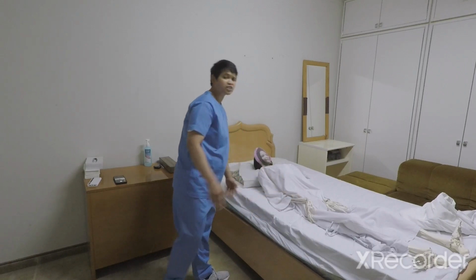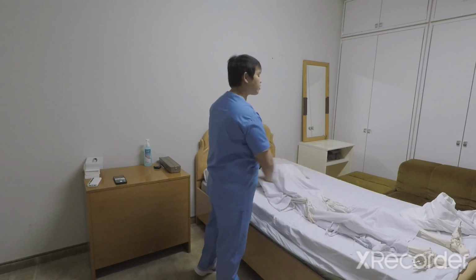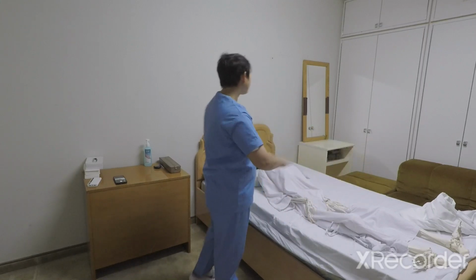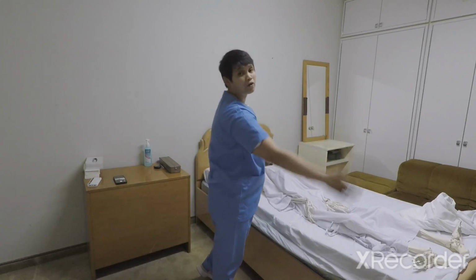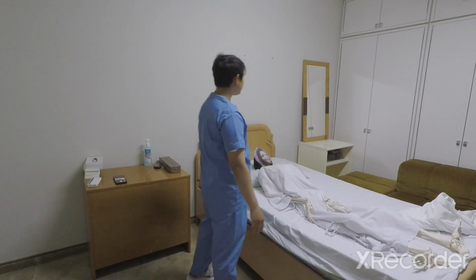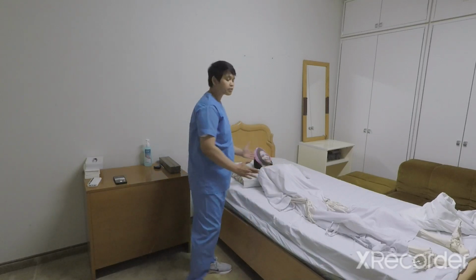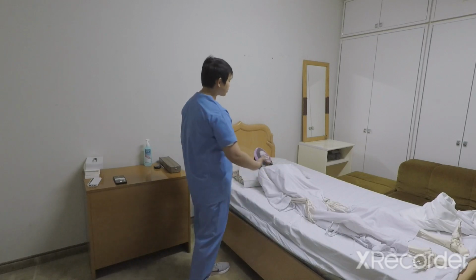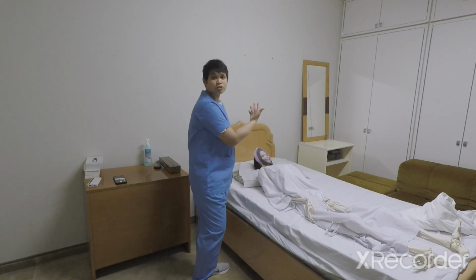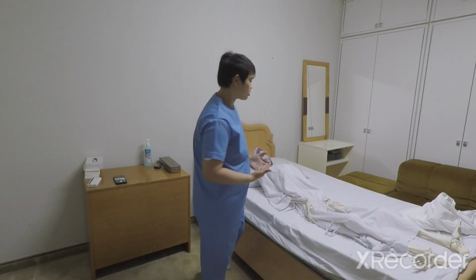In the hospital setting, there will be rails on the sides, one for the upper and one for the lower, or there is one pull rail on the side. Usually, take note that the hospital bed can be tilted up, so we can start with that to prevent orthostatic hypotension.